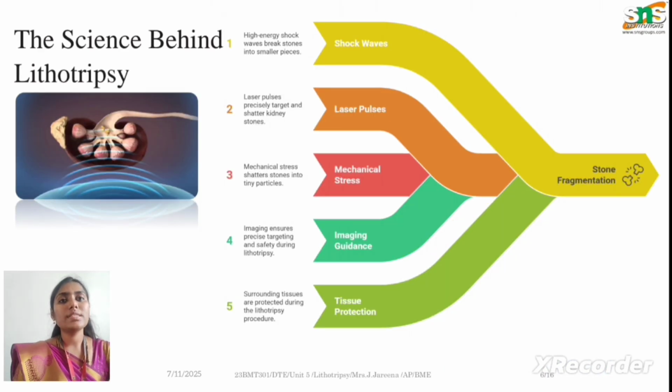So, what is actually the science behind lithotripsy? As I said before, there is a very simple working principle in lithotripsy. They pass very high, focused energy right at the targeted kidney stone, so that this high energy has the potential to break the stones into small pieces. At a later stage, these small pieces easily get out of the body through the natural passage.